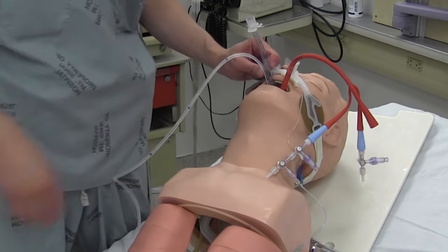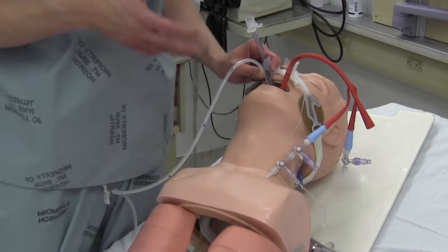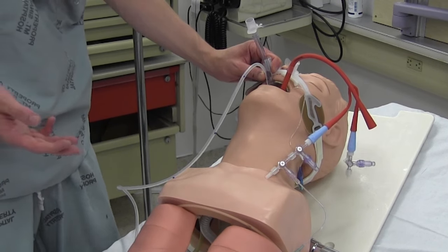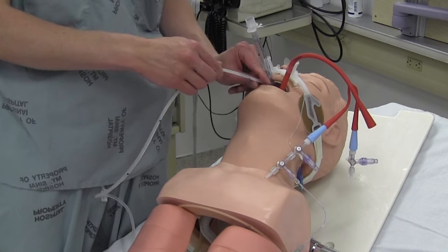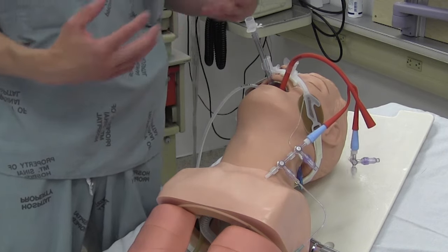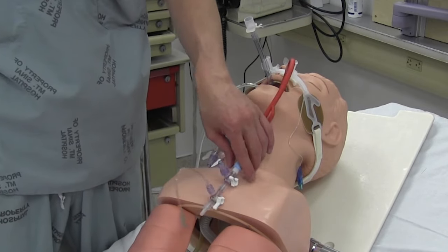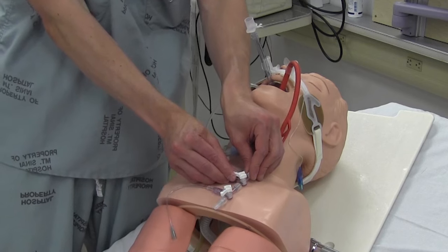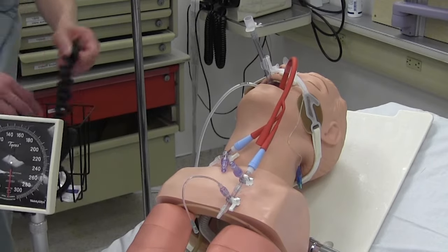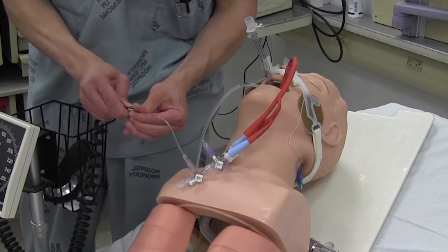Secure the Salem sump. If there's no bleeding, just let this sit until endoscopy arrives or the patient gets TIPS. But if they're still bleeding and endoscopy can't do anything or hasn't arrived yet, you'll want to inflate the esophageal portion. Pull the Salem sump back to where it says esophagus — that confirms it's now above the esophageal balloon. Now inflate the esophageal port, which is more complicated because it's a pressure-based system. Get a sphygmomanometer, which fits into the saline lock.